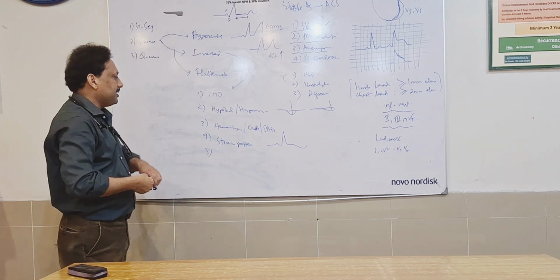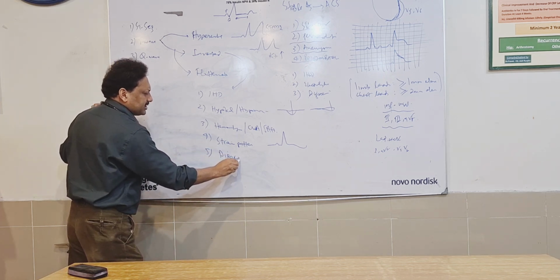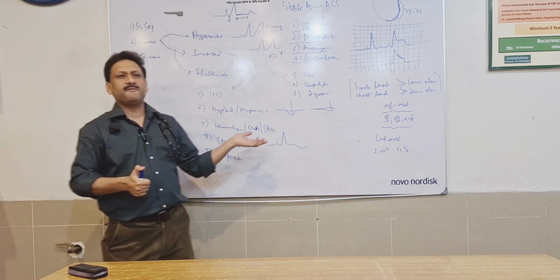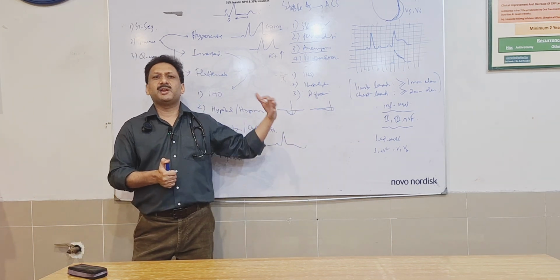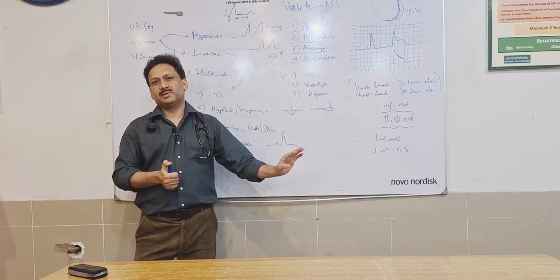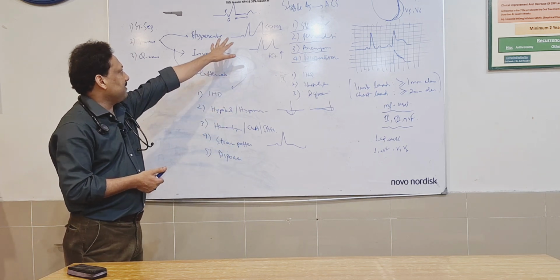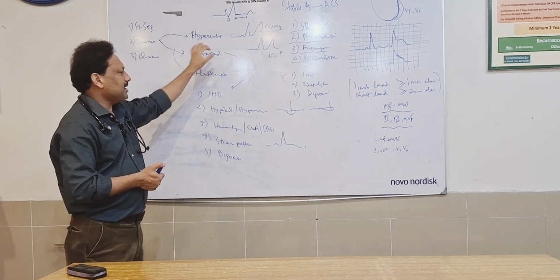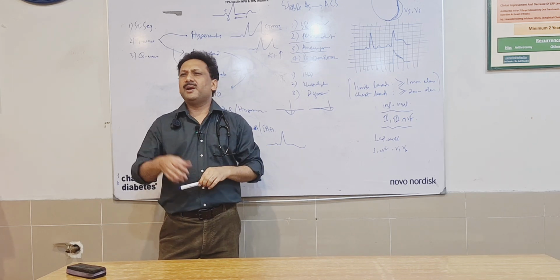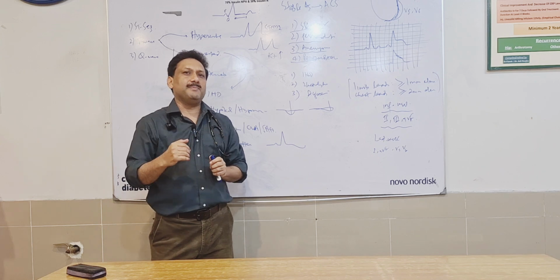So that was another differential. Then digoxin toxicity. There are other drug toxicities as well. One of the reasons might be digoxin toxicity in the setting of T wave inversion. There are many other reasons, but I just want to highlight few of the important ones, right? So that's all about T wave inversion, T wave elevation, and in the states where it gets flattened, that is usually seen in a dynamic process of hypokalemia.